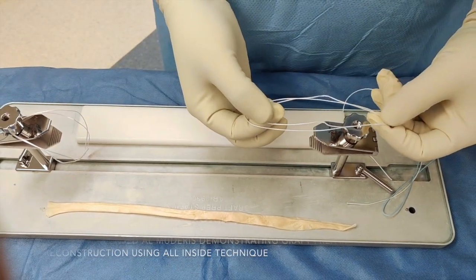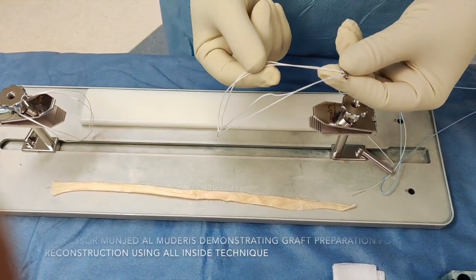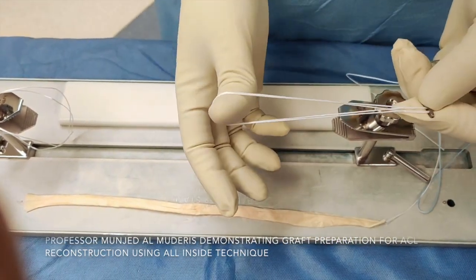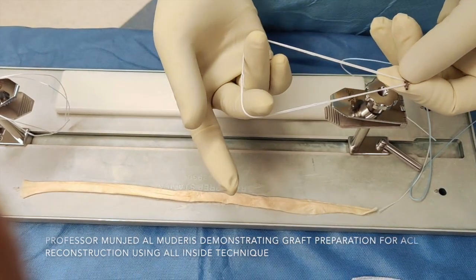Positioning the graft in the tightrope is very important. The tightrope is prepared where I can lengthen the arms of the tightrope from each side — each arm should be separated. It's very important not to make a mistake with the tightrope position, as this will prevent the tension. You need to be careful when you apply it. This is the correct position.